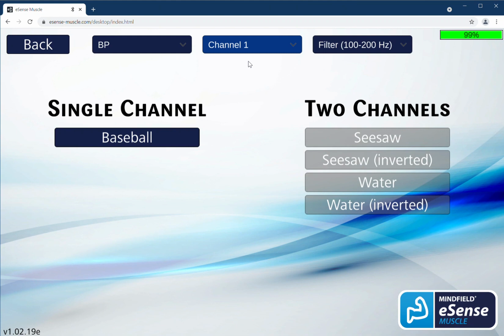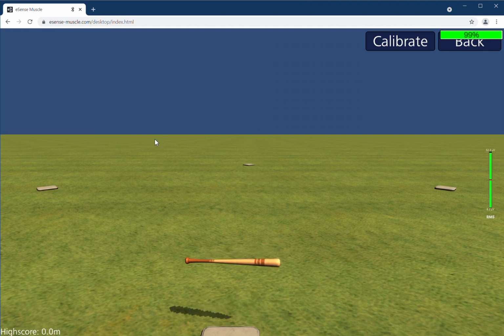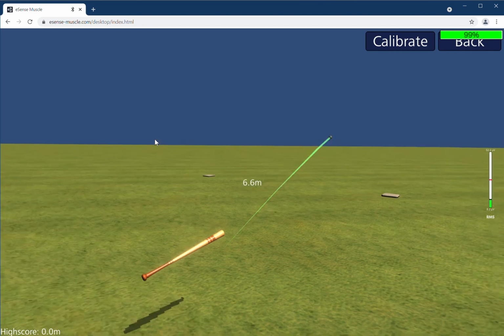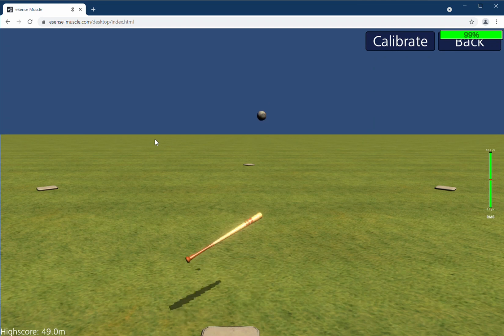Now I change to channel 1 here to show you the baseball animation. In this case, this is about the correct timing of muscle contraction. You see on the right side there is a small green bar with a red threshold in the middle, and when I contract my muscles, you see it goes up and over the threshold, and then this baseball moves and hits. Now I need to have the right timing to hit the ball, and that needs a little practice, not to hit too early or too late. So it's about the right timing.